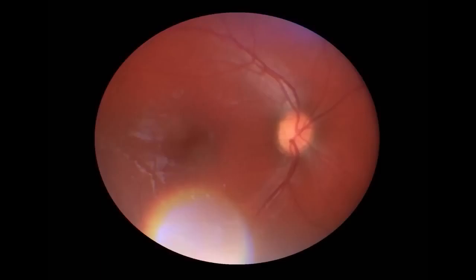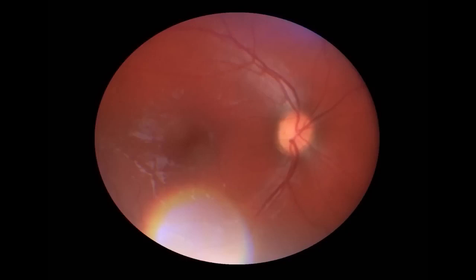Conversely, if you are seeing a white tail on the bottom of the image, SmartScope is probably too close to the eye and you will need to withdraw it very slightly. Also, make sure the camera is not angled upwards or downwards but is positioned directly perpendicular to the patient's pupil. This will prevent light from entering either side of the eye cup.